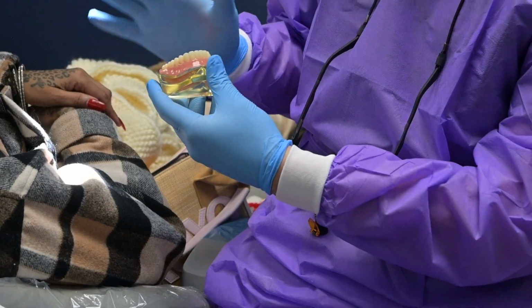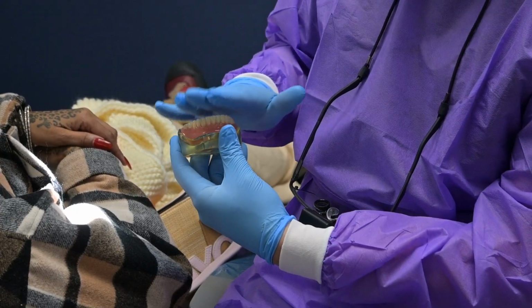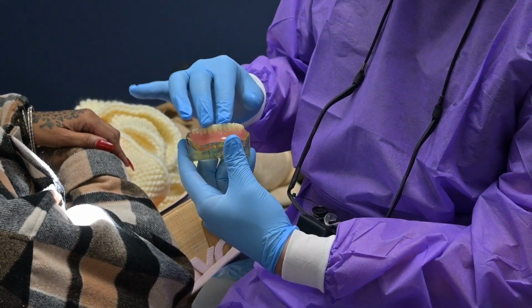Even though the dentures are very well made, there are a lot of limitations with a completely removable prosthesis, especially during speaking or chewing. It's going to be a little bit challenging for them, especially if they haven't worn any removable restoration before.